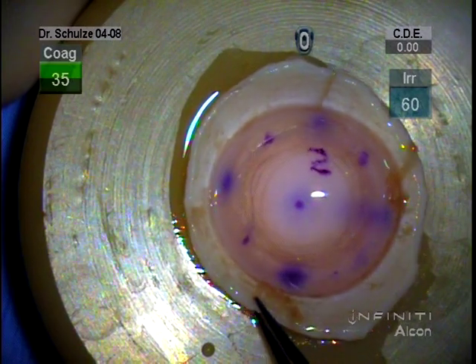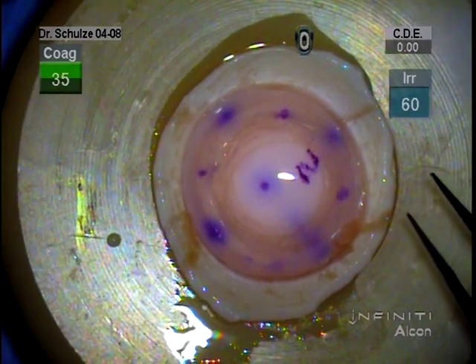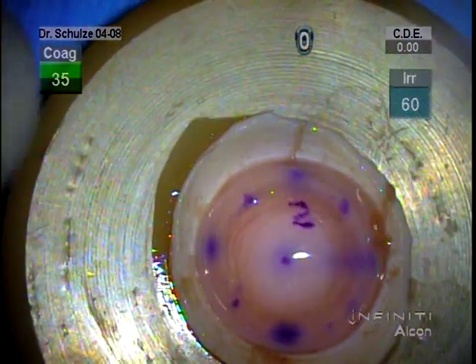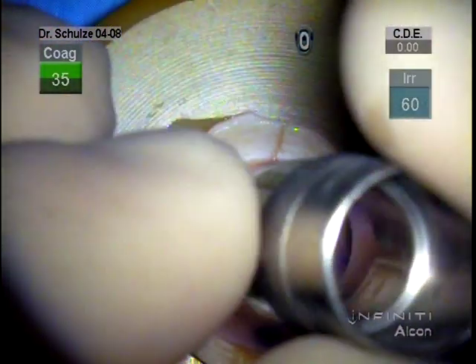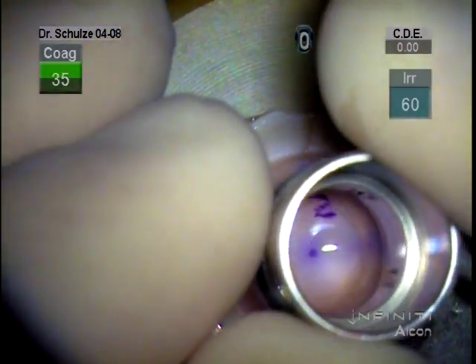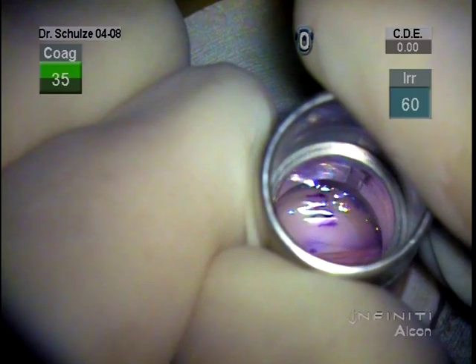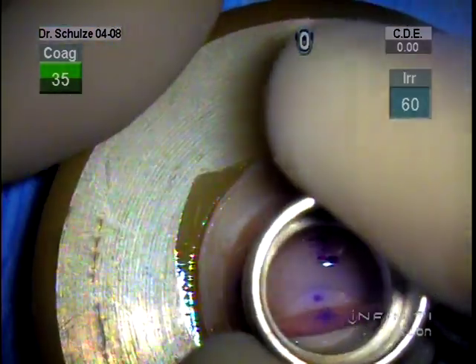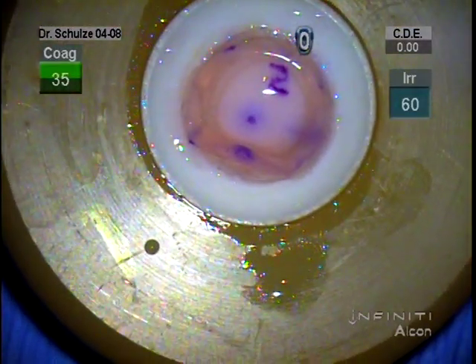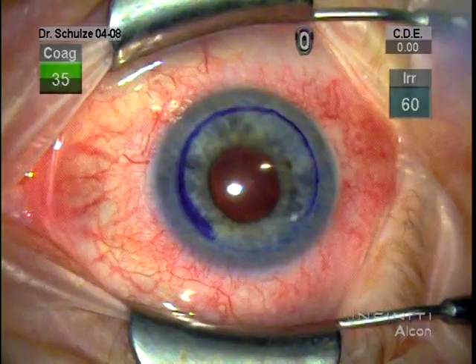We then flip the cornea over facing endothelial side up on the trepanation block. And you can see the marks that we've made on the stromal or epithelial side of the donor to help guide centration of the trefine. Now, the camera on my microscope is not exactly coaxial with the oculus of the microscope, so this looks almost off-center. But in fact, the trepanation is centered within the margin of the lamellar dissection done at the eye bank.